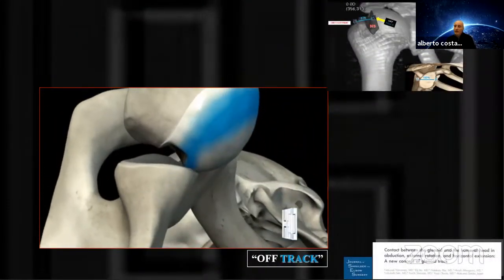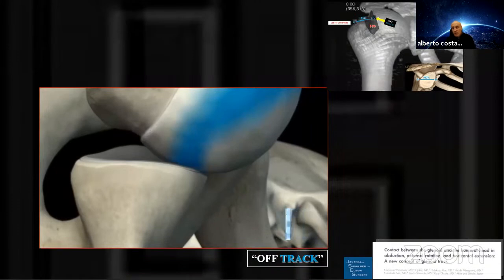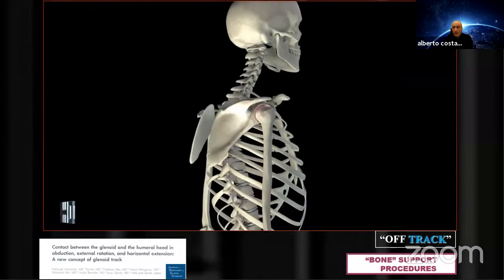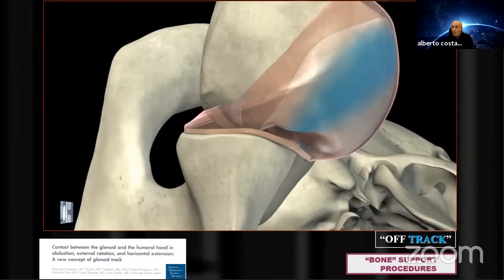But instead, if we have an off-track lesion, it means that the Hill-Sachs is not lateral, but more medial, and this involves the bony support. Now we are defining this lesion as off track. We also see, on the same CT scan where we measure the glenoid track, that now the Hill-Sachs is outside the glenoid track. So this shoulder would be unstable even when we repair it arthroscopically. So for the off-track lesion, we recommend a bony support procedure.